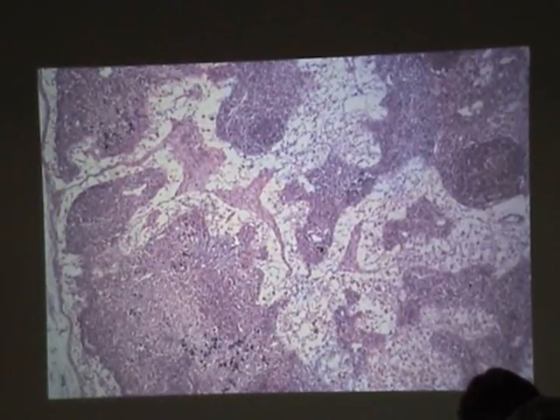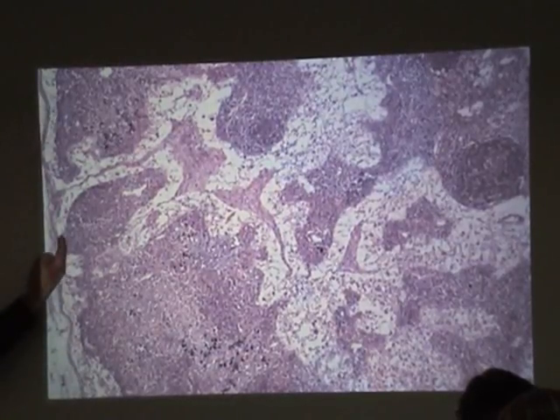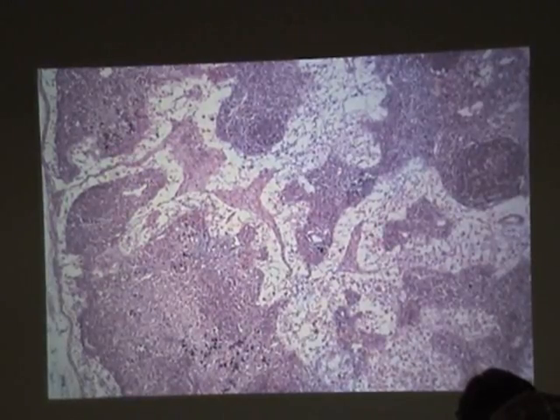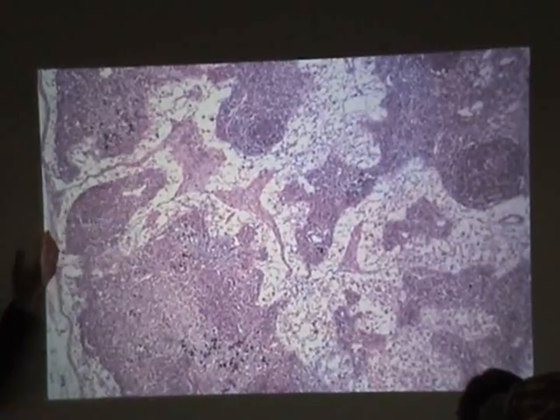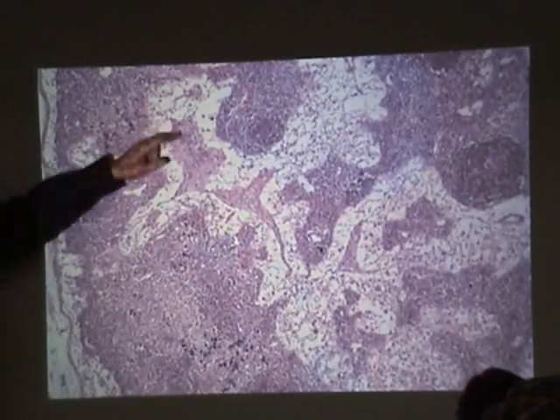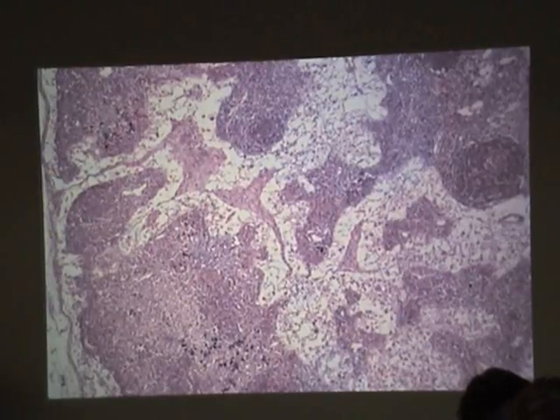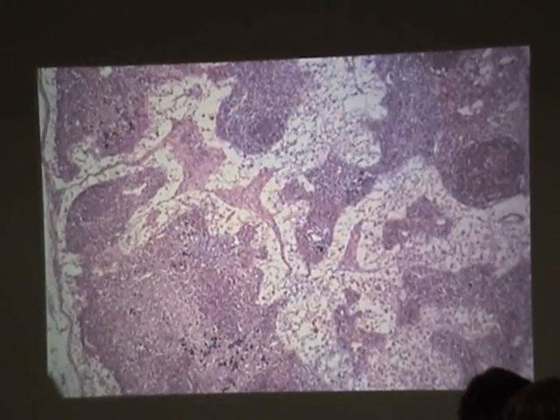Again, I showed you these in lecture. They're oriented differently. So here's the connective tissue capsule. This is that subcapsular sinus. Sometimes it can be really filled with cells, so it doesn't show as well. And then here's a trabecula. You can see the continuity with the capsule. So, trabecular sinus. These connective tissue trabeculae move all the way to the medulla, and then in between, what do we have to help provide the organization? The structural support. Reticulum.